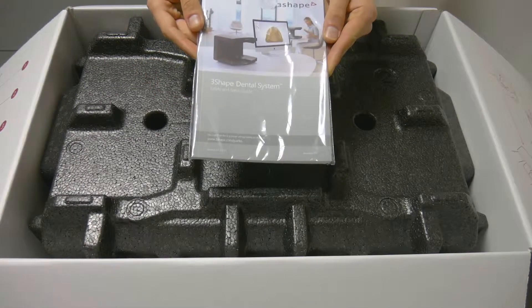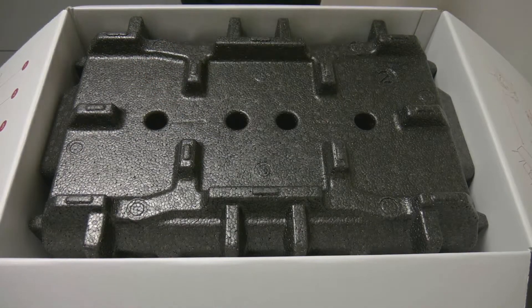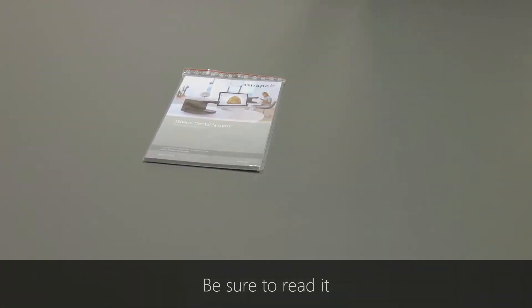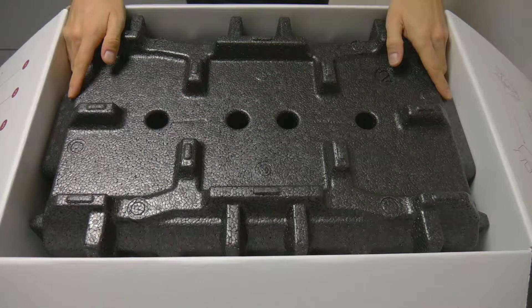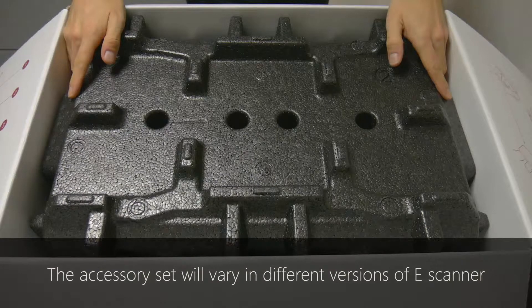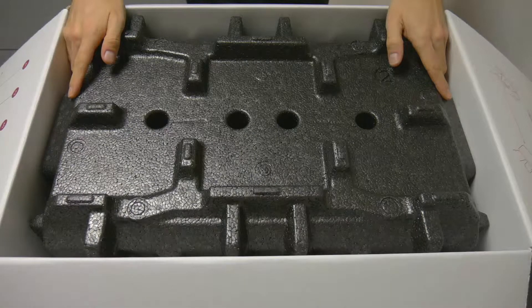Start by taking the manual out of the box. There are three inserts in the box. When pulling them out, you will notice that there are many accessories inside. Please remember that the set may vary depending on which scanner version you have. The one shown in this video is for the E1 scanner.